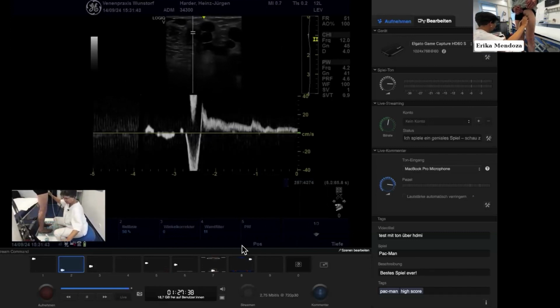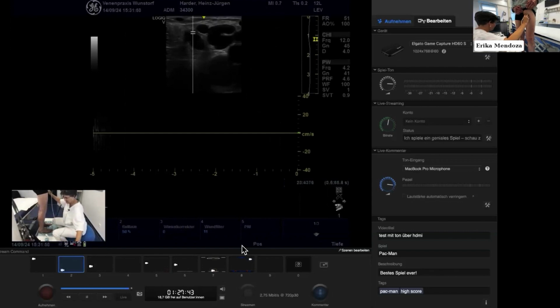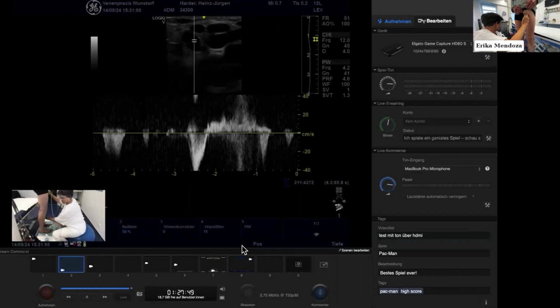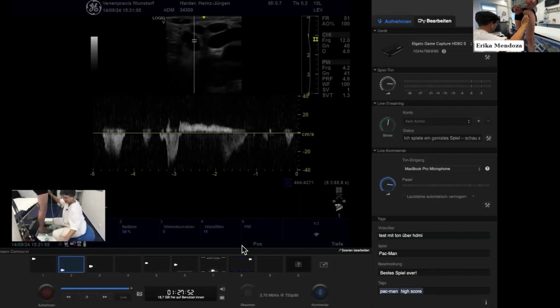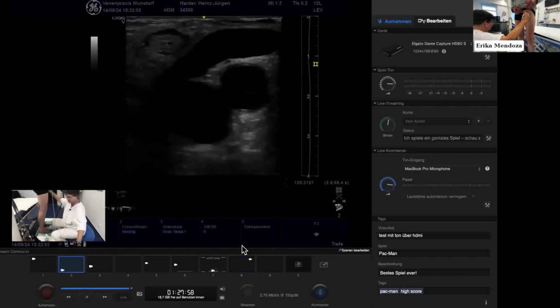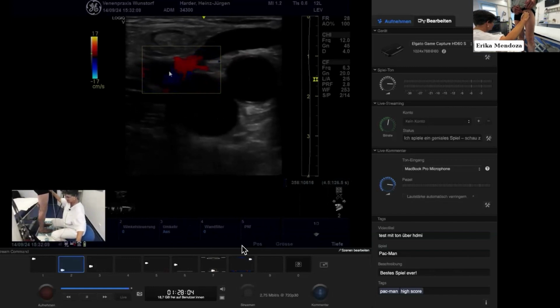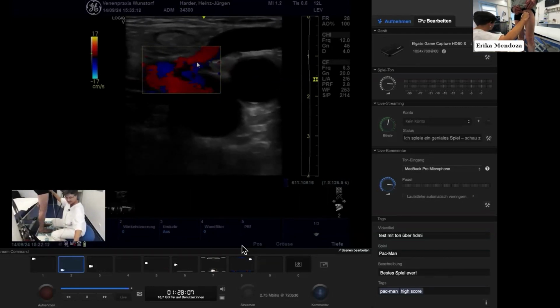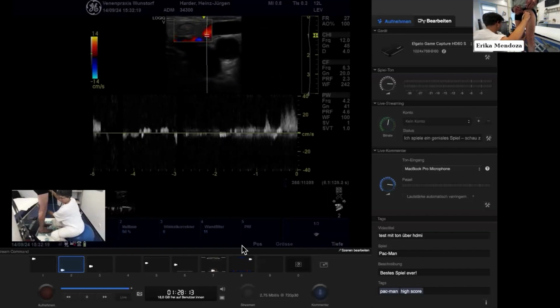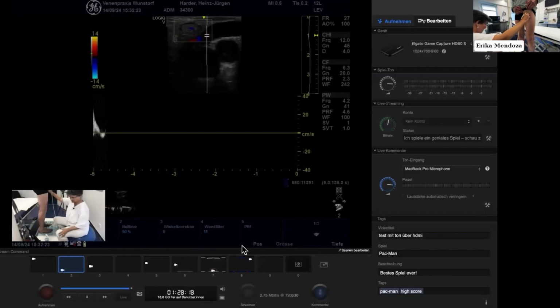and it is refluxive, but we see that the saphenofemoral junction, we will see it here. Here we have it. It is refluxing, but not so much. It stops a little bit. The most important reflux thing is the accessory anterior vein here. You see them both. This one is the great saphenous. This one is the anterior accessory. And we go inside to measure. Perfect. And you really see a large reflux.